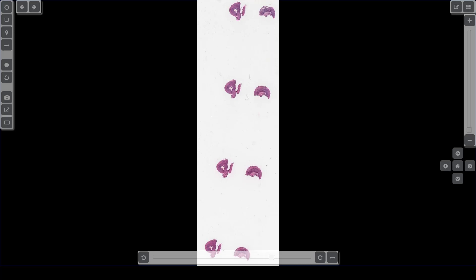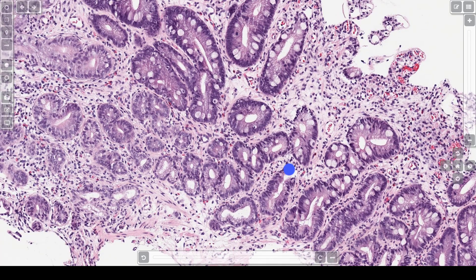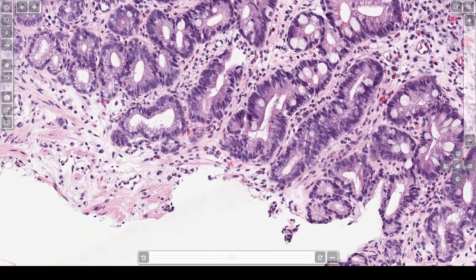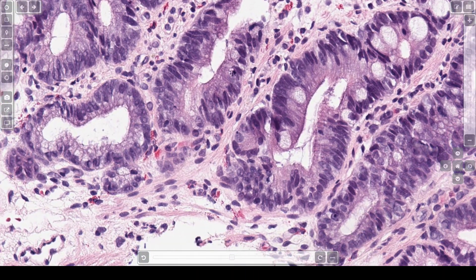This is from the same patient but a few years later. At this power, you can see the Barrett's esophagus is still present because there are numerous goblet cells. In addition to the Barrett's epithelium, some of the nuclei have an elongated look — right here, and right here, and also right here. This is what we call low-grade dysplasia. So the diagnosis is Barrett's esophagus with low-grade dysplasia.